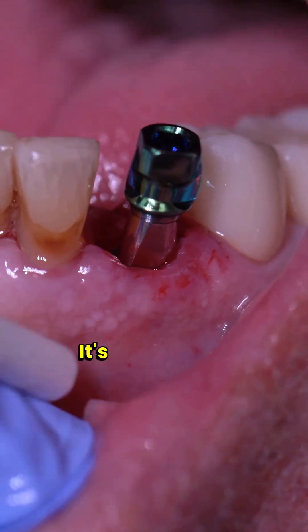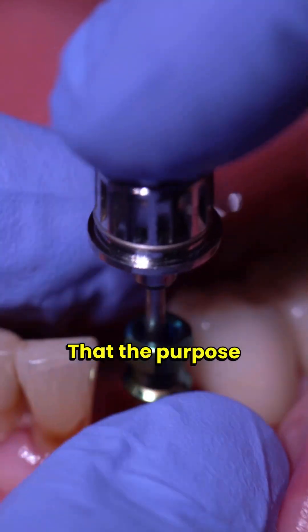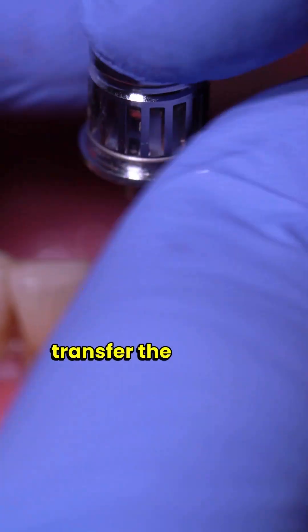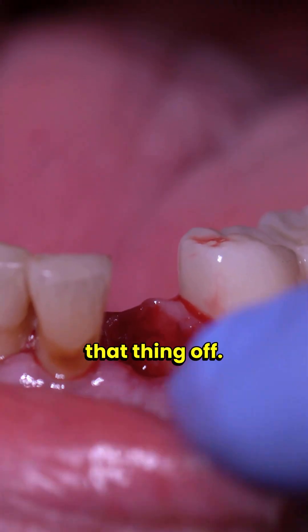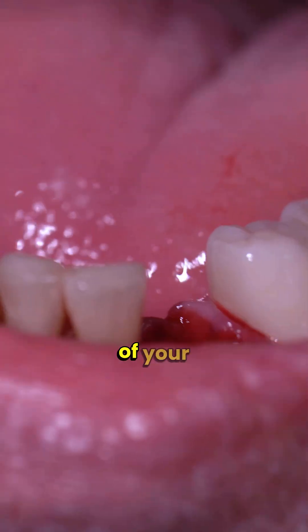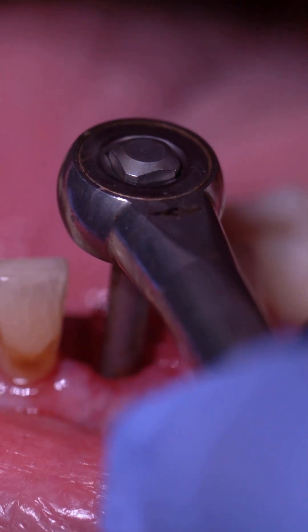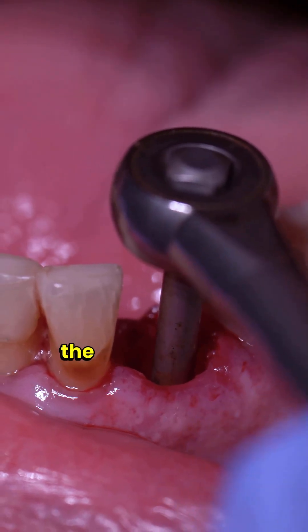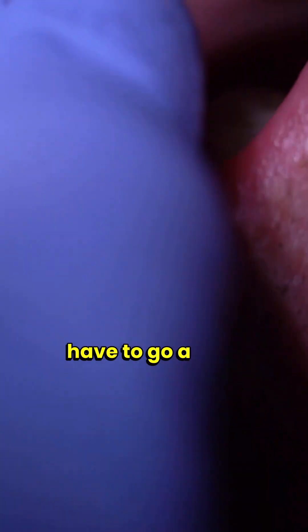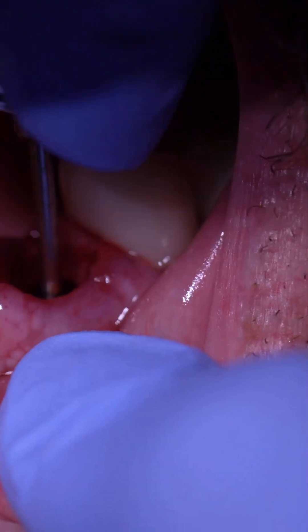Boom, it's right where I want it. The next step is to take off the transfer — that green piece basically transfers the implant from packaging to the socket. Once the implant is engaged I just take that off. Now evaluate the depth of the implant platform: you generally want your platform to be 3 millimeters apical to the CEJ of the adjacent tooth. I'm doing a little fine-tuning with a wrench, taking the implant just a bit deeper, and when I'm happy with it I can put on a cover screw or healing abutment.